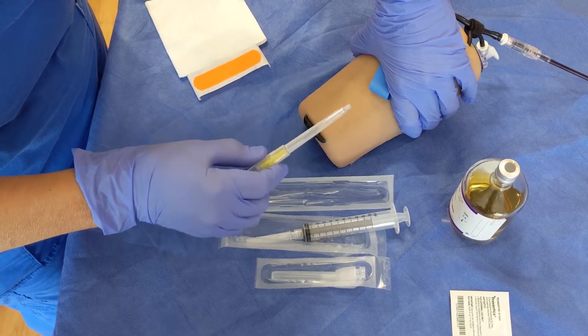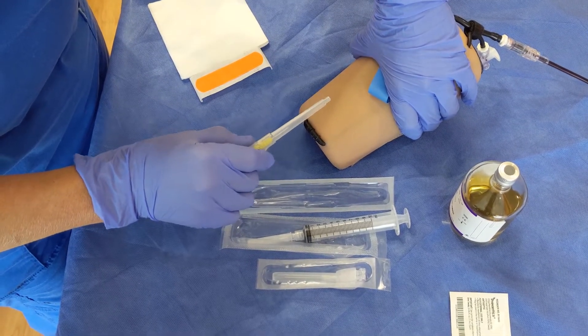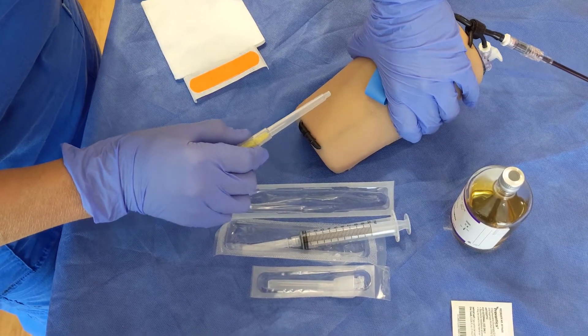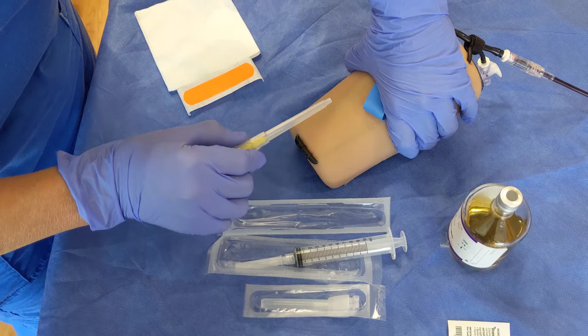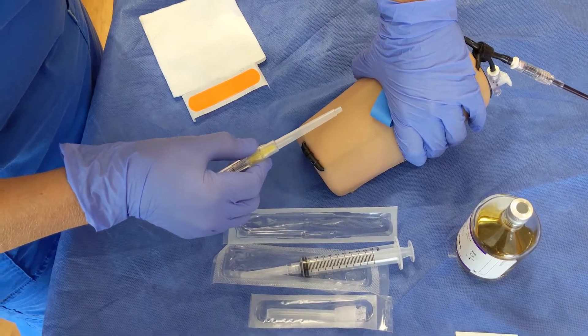The nice thing about using a PIV catheter is that after you insert that needle, once you're in and you have flash, you can take that needle out and you only have a plastic catheter sitting in that vein. So the blood's going to come out.